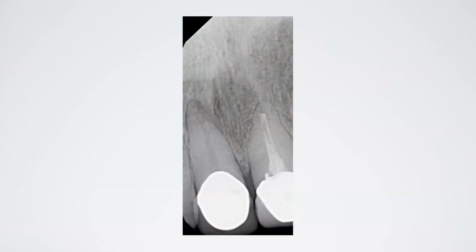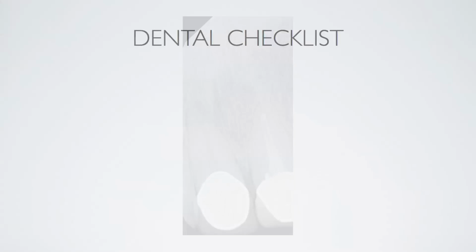At initial glance, this case may seem straightforward, but let's look at some of the nuances that may be challenging throughout treatment. To help us increase our success rates and decrease our procedural errors, I devised a checklist that I use in every endodontic case, inconsequential of its perceived complexity.